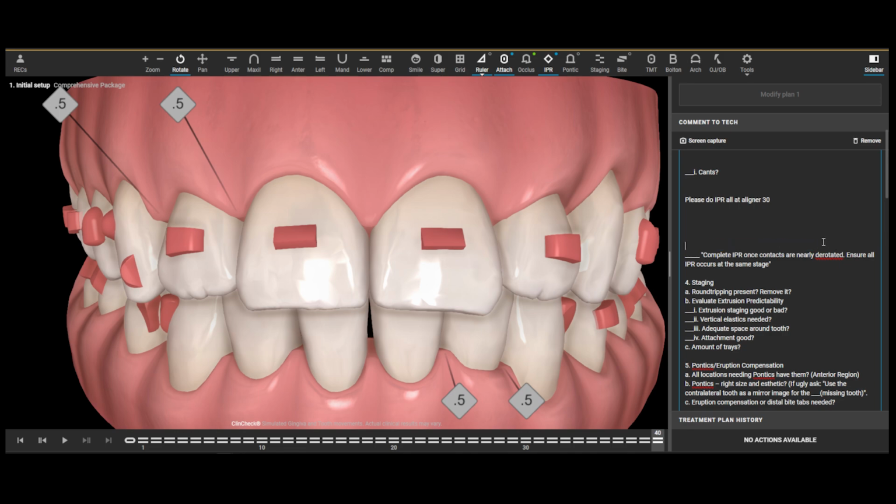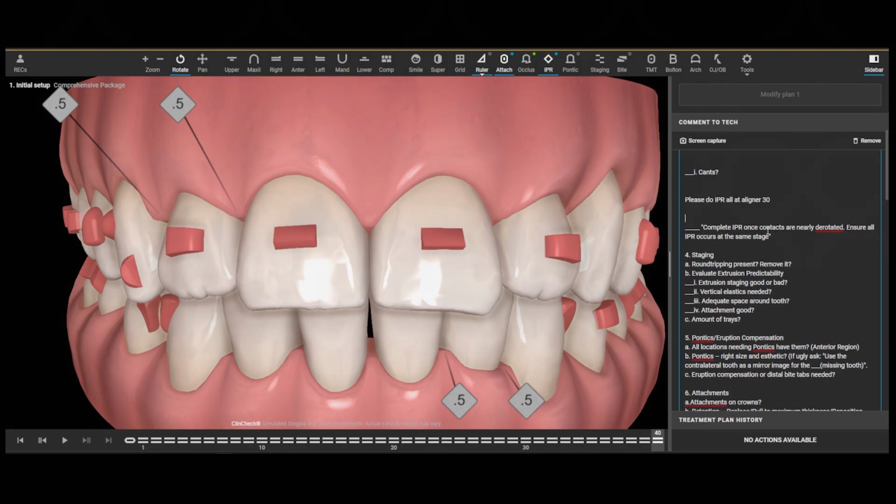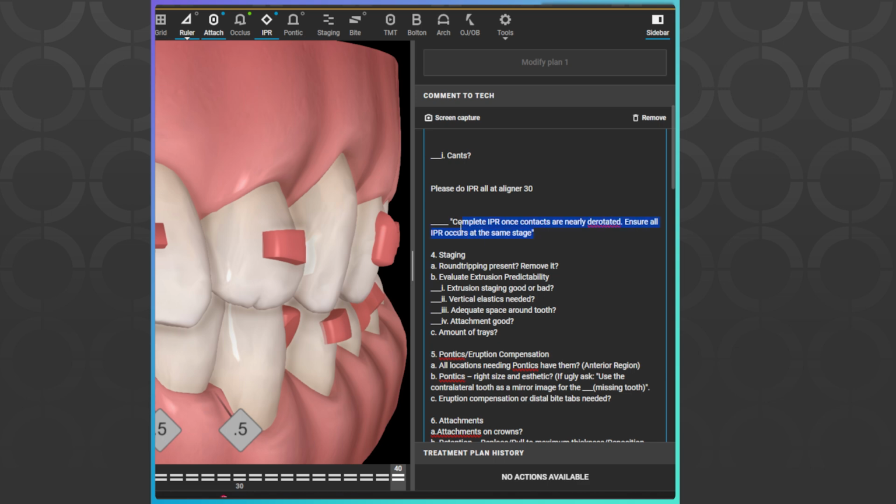Okay, let's say that they did not give you the proper IPR here. You can copy and paste this exact sentence: Complete IPR once contacts are nearly derotated. Ensure all IPR occurs at the same stage. That's the phrasing that I use because if you say fully derotated, they'll always give you a bunch of extra trays that you don't need. Whereas if you say nearly derotated, then they'll usually be more efficient and not give you 70 aligners and then finally derotate the teeth by like 68.